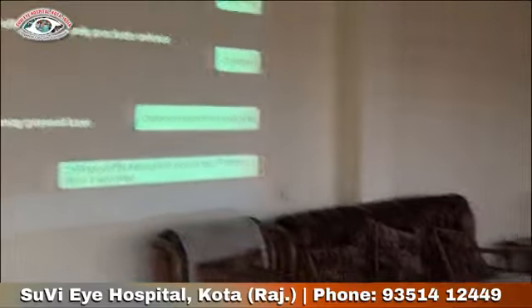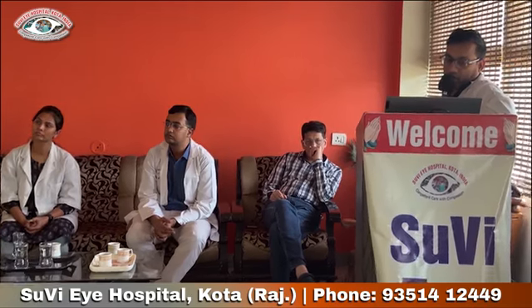And if there is a dense cataract or media opacity preventing the laser, we can do it after cataract surgery. And in combined PDR and DME, we should do PRP along with the macular laser, and temporal PRP we can do after 1 month.